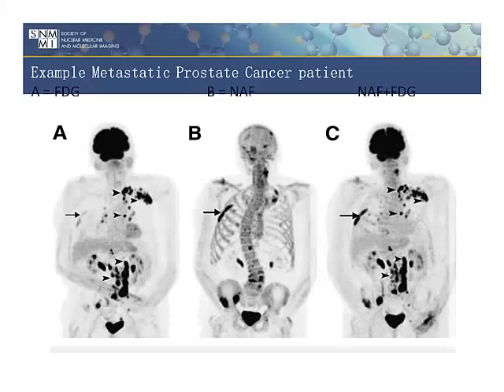As you look at both, this is how you always know FDG: you've got brain activity. No brain activity on sodium fluoride. Sodium fluoride will not have anything but bone. You will sometimes have a little soft tissue just because there can be a little blood pool activity, things like that. But think about a normal bone scan, and look at how much clearer this is. And this is actually blurred because it's pasted into the PowerPoint. But you can see each rib, each bone, each separation of the spine, hips.